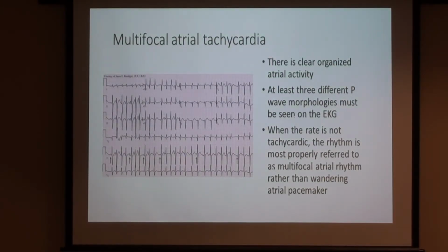It's called atrial fibrillation all the time. Well, it's a narrow complex, fast, irregular rhythm, but it means something very different. I mean, how many of you want to take Coumadin if you don't need it? You're going to guess that's a short line, right? That's not a line you're going to sign up for.